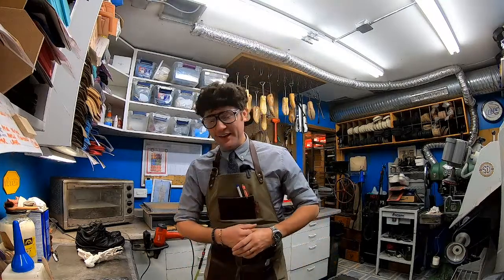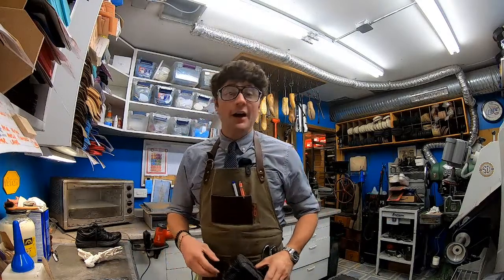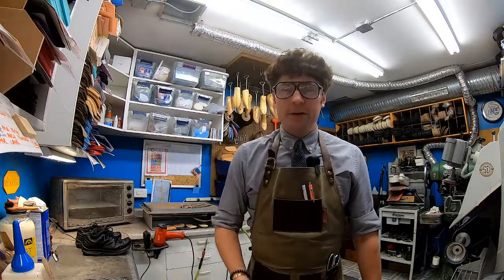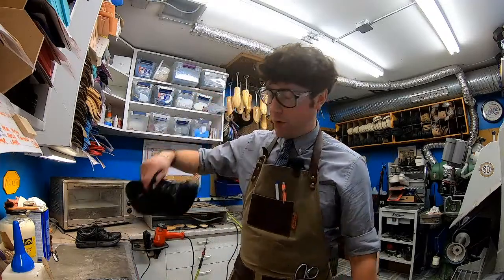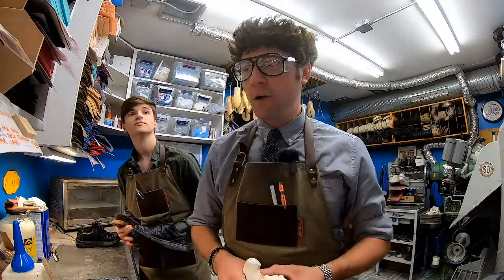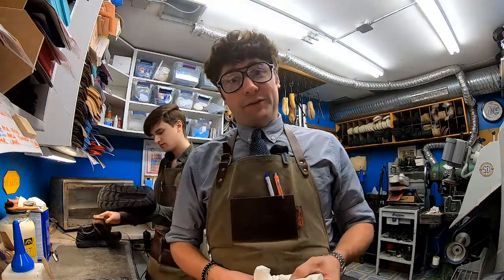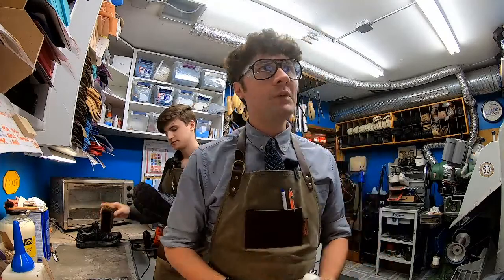We are coming at you with a little bit of a complicated situation, pretty simple as far as the solution set goes. We have a lovely young mother with terrible plantar fasciitis, about 2 years of dealing with this pain. She's been on and off. She came in, invested in a set of Saucony Echelon walkers as well as Power Step Plus with a little met pad on there. It was working out well, but she went in to get a cortisone shot with her foot doctor about a month or 2 ago.